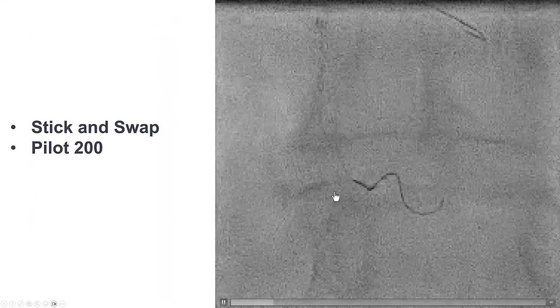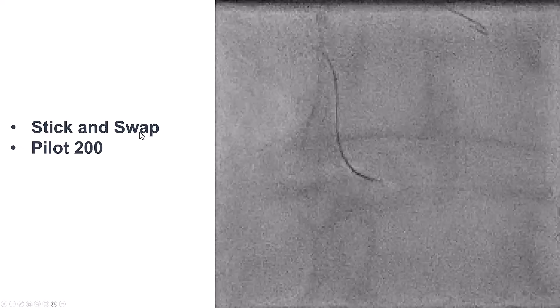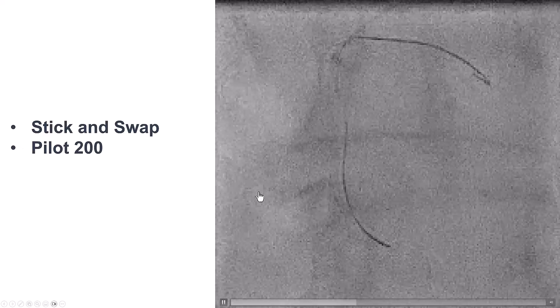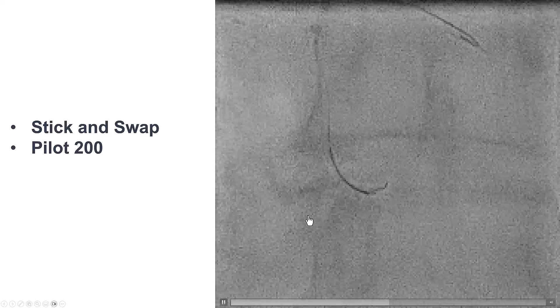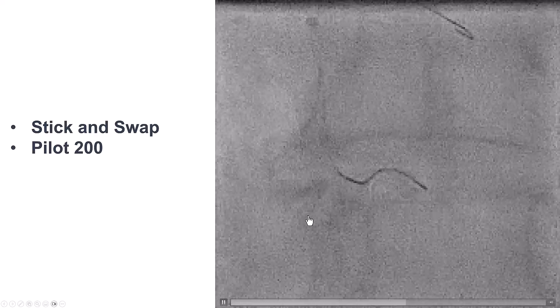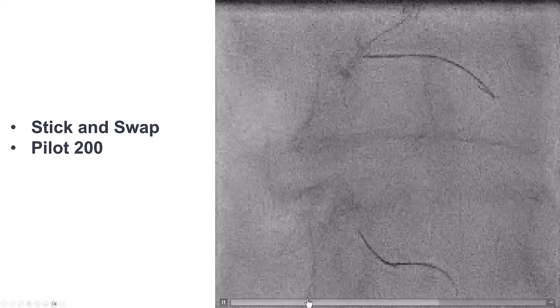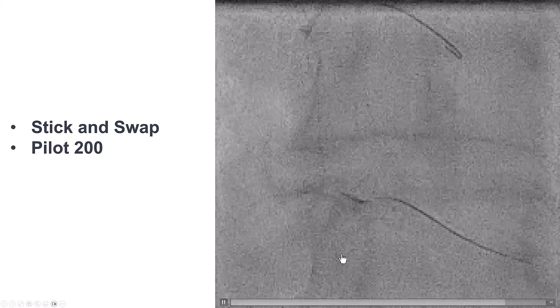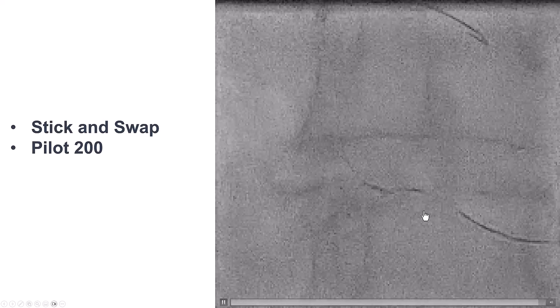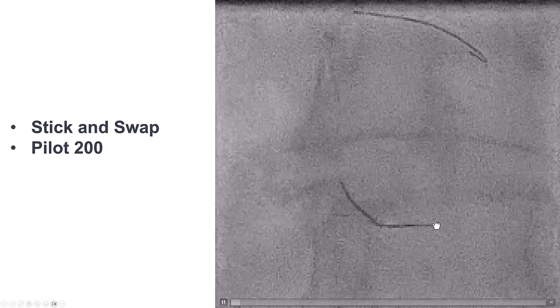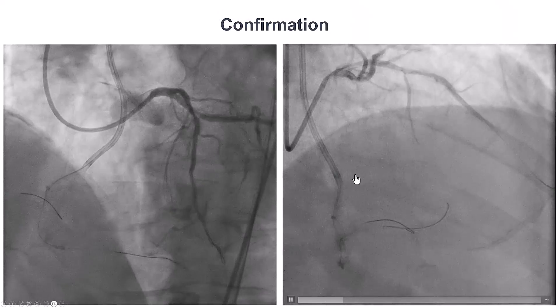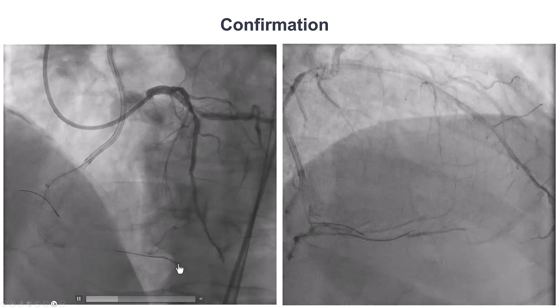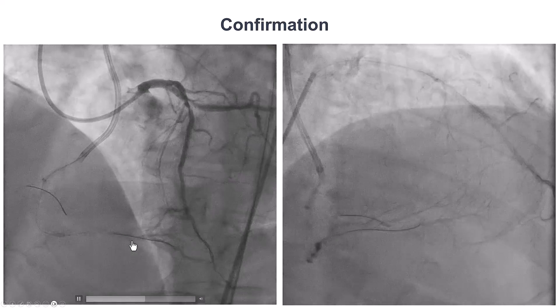We performed the stick-and-swap technique, using a stiff guide wire to puncture and then a Pilot 200 to switch, given the diffuse disease and calcification in the vessel. It took a few attempts, but eventually through the superior-facing port of the stingray we were able to advance the guide wire. With contralateral injection, we confirmed that we were in the distal true lumen.